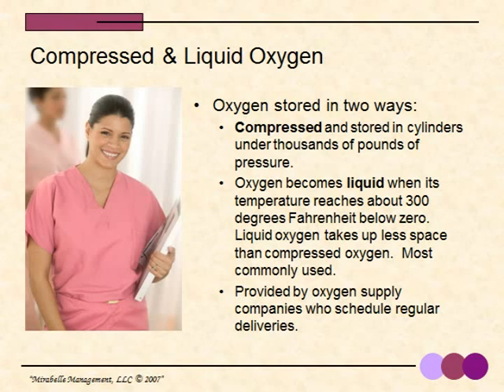The most commonly used form is liquid oxygen. If a person uses liquid oxygen, an oxygen company or provider will set up one or more liquid oxygen reservoirs or cylinders in the home, and they will schedule regular visits to fill these reservoirs.